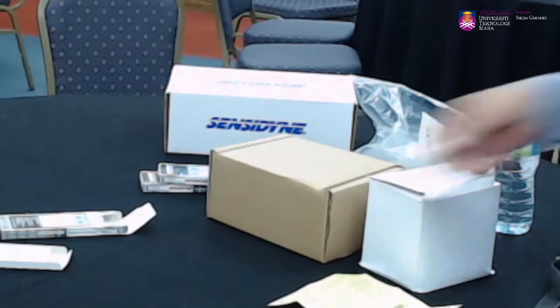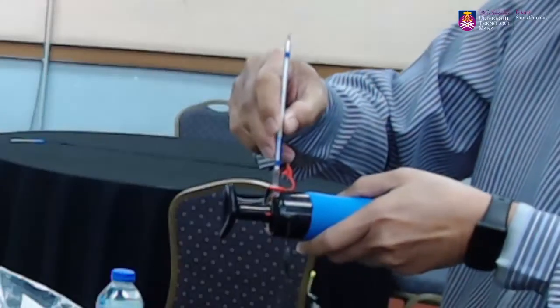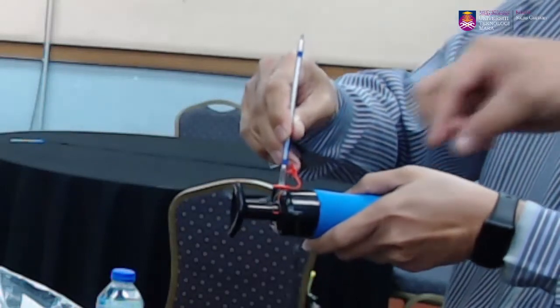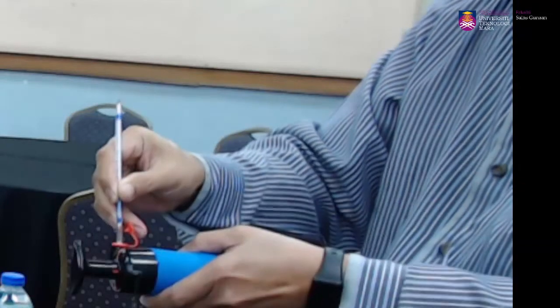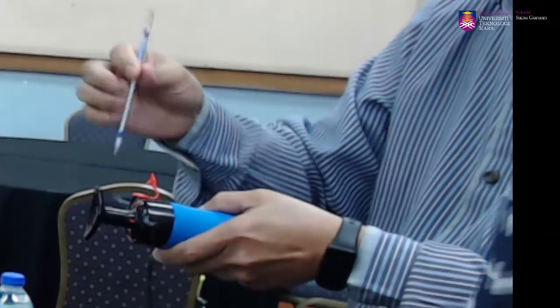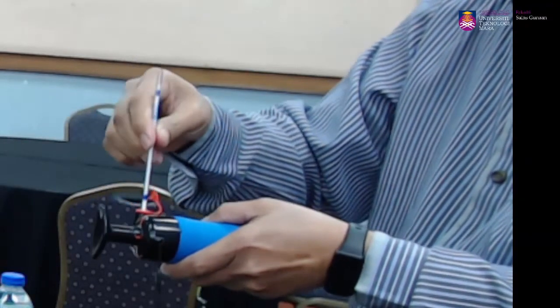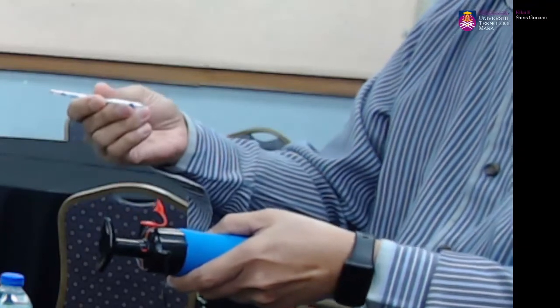Saya dua tangan aja, yang instrument I masukkan. Pusing sikit, bagi dia celah and then patahkan ke kanan, ke kiri. Bismillah. Dah. Okay, satu. Next, sambung masukkan. Pusing sikit. Yes. Okay, baru kita pasangkan, connectkan. Kita connectkan dia dari sini.